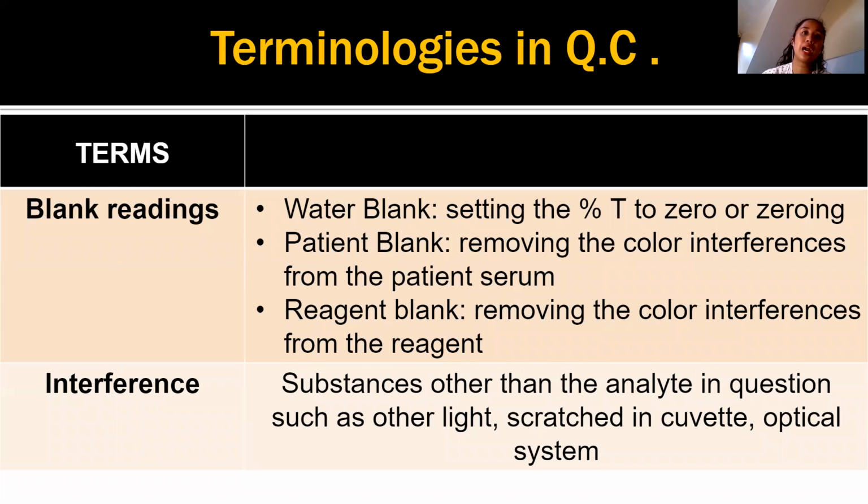Okay, class, we will encounter these terms. We have blank readings. Let's make a water blank. When we make a water blank, we set the percent transmittance to 0, or zeroing, in spectrophotometry. Just hold that thought, you will understand it later. Then the patient blank.